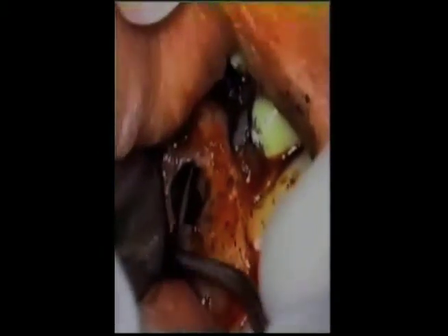In this procedure, the mesiobuccal root can be seen very clearly. Ultrasonic tips are used to easily clean and prepare the canals for retrograde fillings. Seeing root slivers is possible using high-power magnification, which many times in the past using conventional methods was not possible. A coagulant is applied for hemostasis. A retrograde filling is now inserted and condensed. After being inserted, the retrograde filling is inspected with a micro mirror. Demineralized freeze-dried bone is used as well as an absorbable barrier.